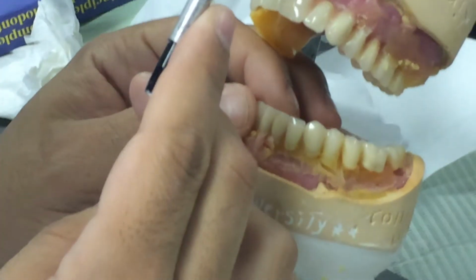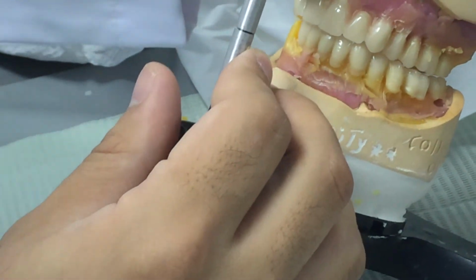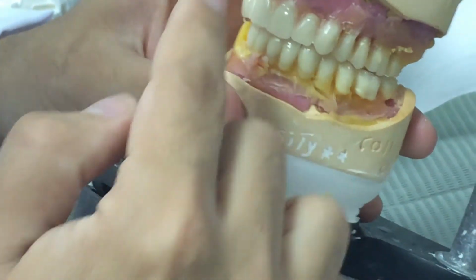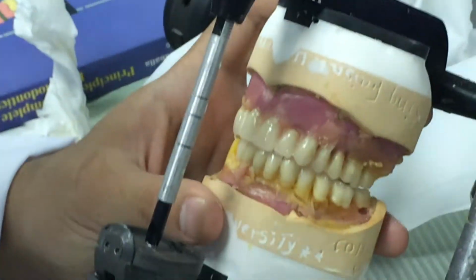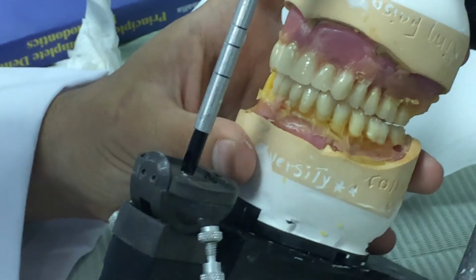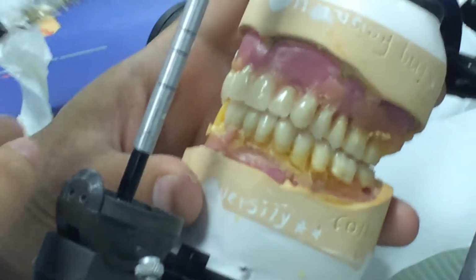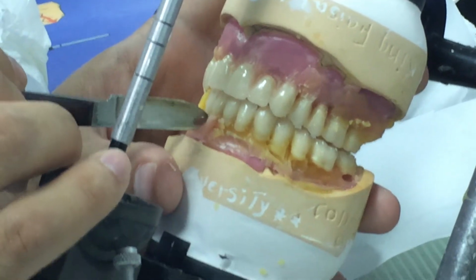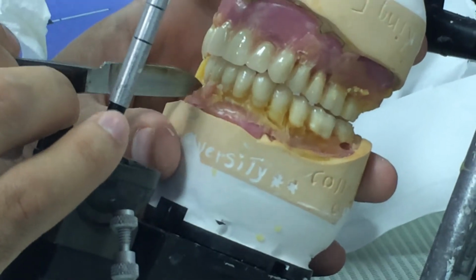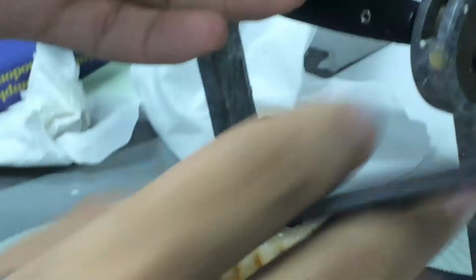And some other thing is you have to keep the incisal pin locked here. Otherwise, you'll have later on a false relation while you do setting. So it means it's not the same relation you got from the patient now.